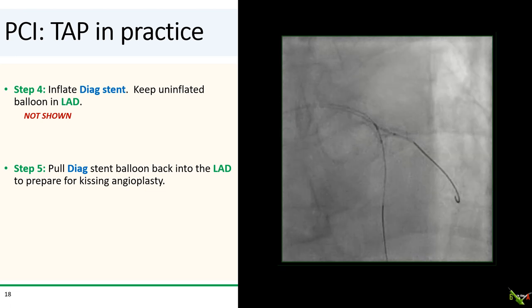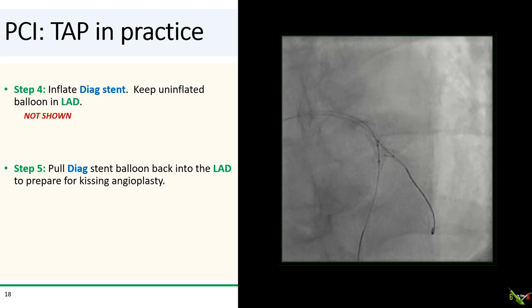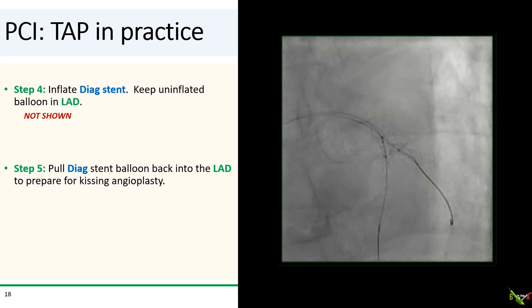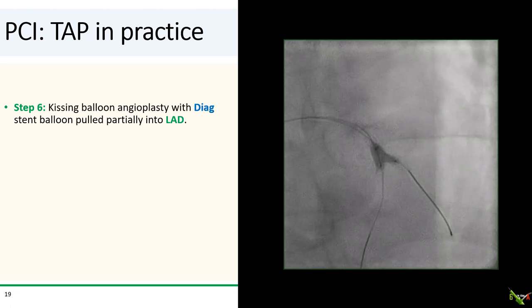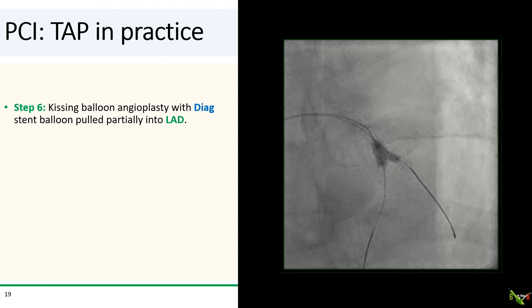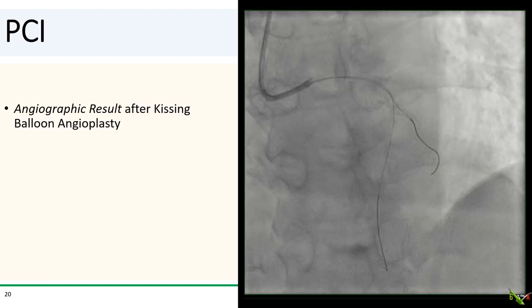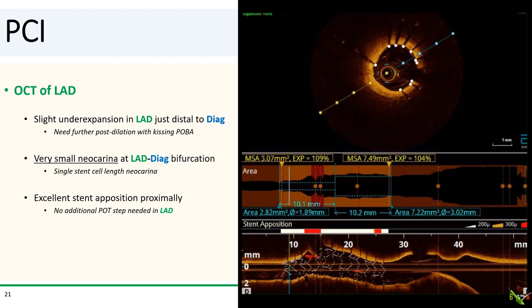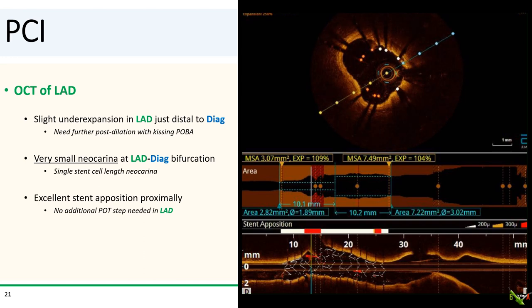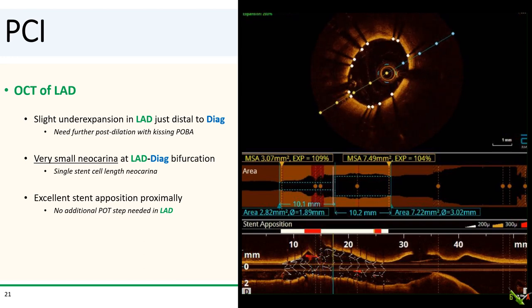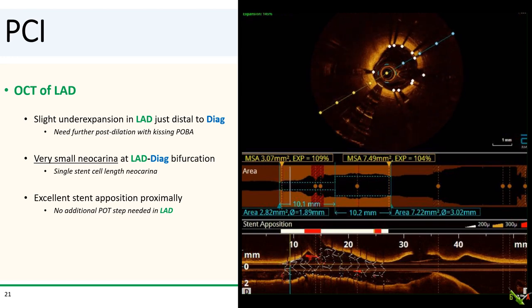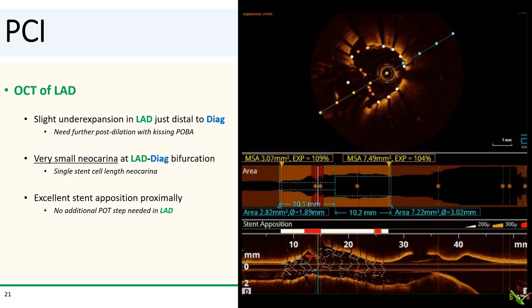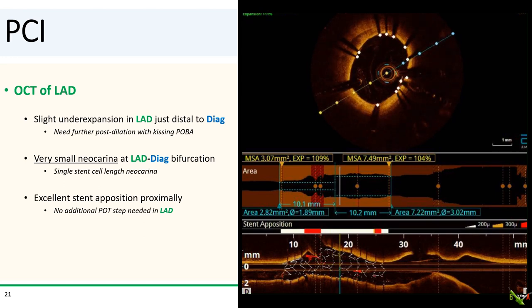In step four, we inflated the diagonal stent while keeping the LAD balloon uninflated. In step five, we pulled the diagonal stent balloon slightly back into the LAD to prepare for kissing balloon angioplasty. In step six, we performed kissing balloon angioplasty of the LAD and the diagonal. OCT showed a slight underexpansion in the LAD just distal to the origin of the diagonal — there was likely a post-stenotic aneurysmal change there, so we needed a bit more post-dilation with kissing angioplasty. The good news is that the neocarina at the LAD-diagonal bifurcation was very small, probably not more than one stent cell in length.